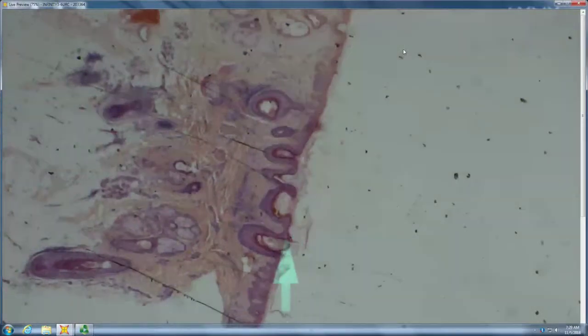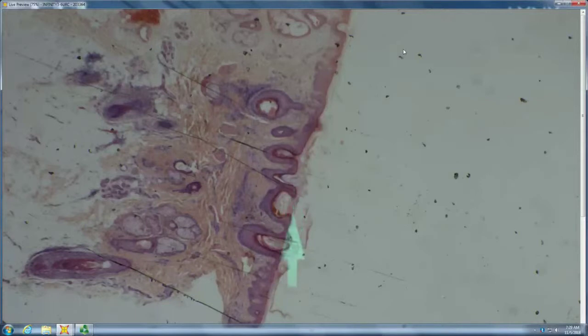One thing that AA does that syphilis does not do is this dilatation of the follicular infundibulum, which in horizontal sections looks kind of like Swiss cheese, and Lila El-Shabrawi in Graz, Austria, has called it the Swiss cheese sign in transverse horizontal sections. So that kind of dilatation of the follicular ostia is characteristic of alopecia areata, not so characteristic of syphilis. So that helps, that this is more likely AA than syphilis.